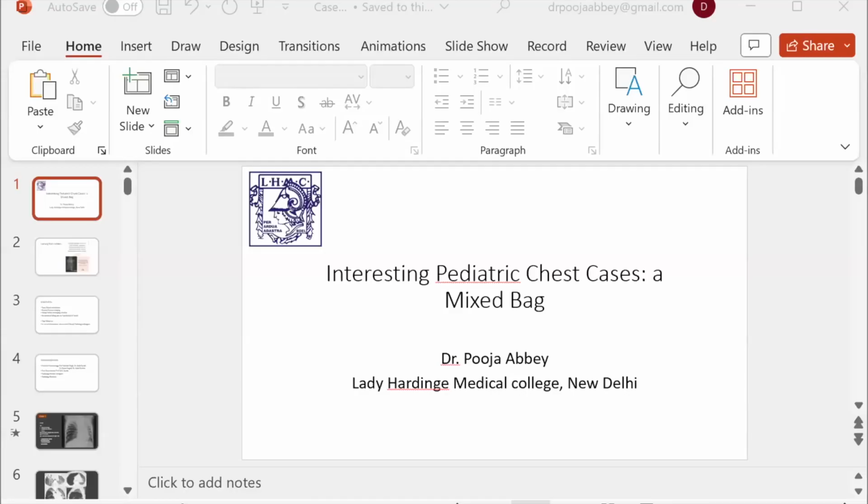But I think that if I had to do this kind of investigation, then probably we would use non-ionic contrast, because the worry is that if gastrografin goes into the lungs, it can draw in a lot of fluid and cause edema. Yes, ma'am. At the same time, if we use barium and it goes into the lungs, it will be inert. But if at all there is some communication to the mediastinum, it can cause a lot of mediastinitis. So I think barium maybe would not be ideal. Yes, ma'am, maybe it would be in small quantities if we are using non-ionic contrast.